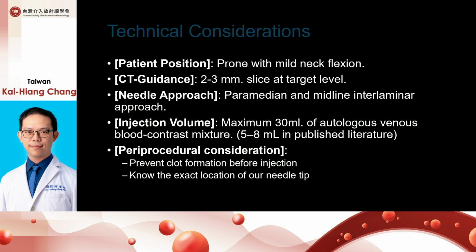There are also some peri-procedural considerations you must think about. The first one is how to prevent the blood from clotting before injection, and secondly, to know the exact location of your needle tip.